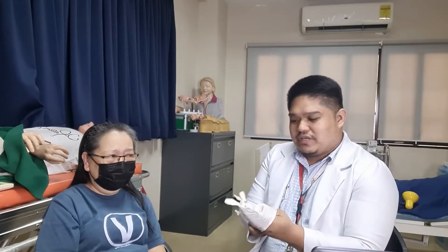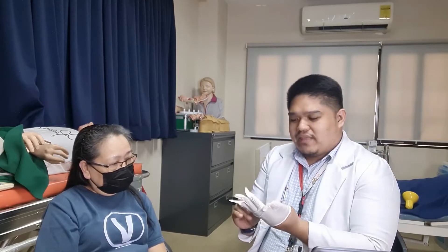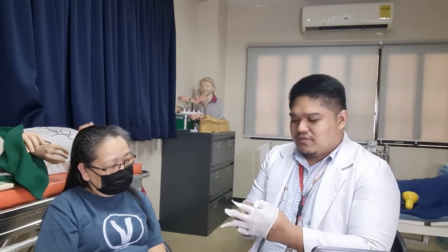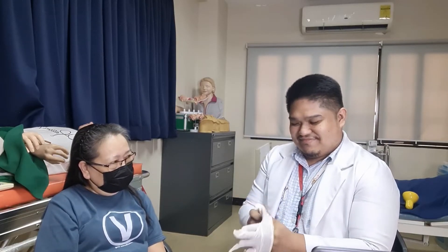We have to apply our gloves after doing hand hygiene. It is necessary to perform hand hygiene prior to the procedure and after, to prevent cross-contamination of microorganisms. Make sure also that you have provided privacy to your client by closing the curtains or doors. Make sure that you have well-fitted gloves.